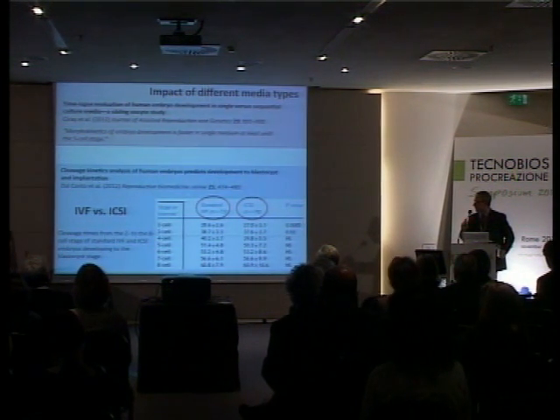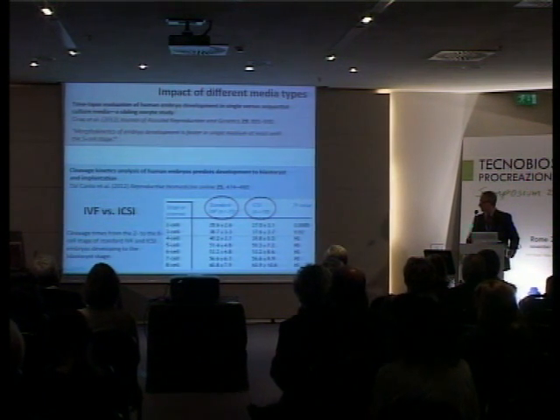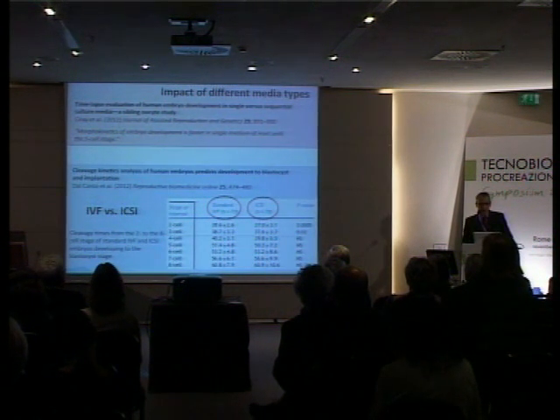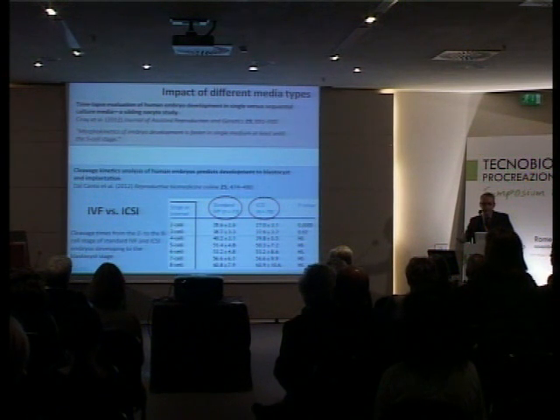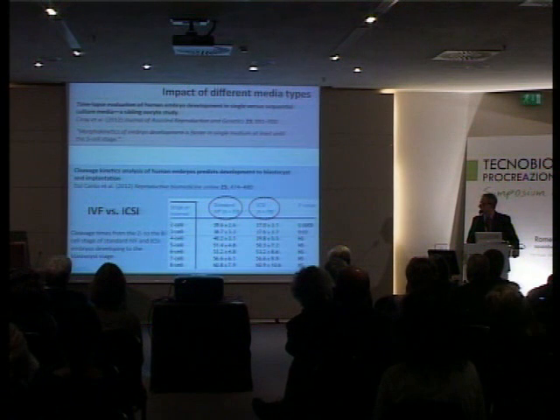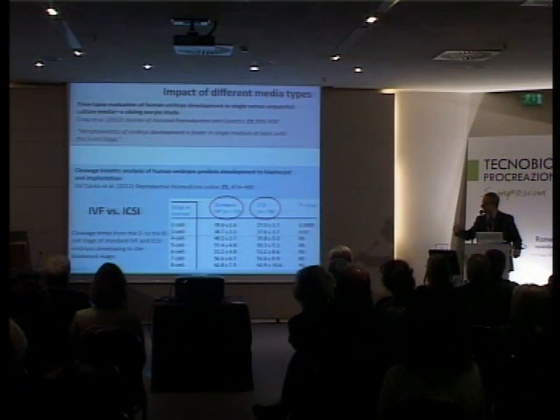We have done some observation over the last year or so with our time-lapse microscopy device. And in this study recently published, we have in fact compared the development, morphokinetics, in fact, of IVF versus ICSI embryos, from the 2-cell stage to the 8-cell stage.